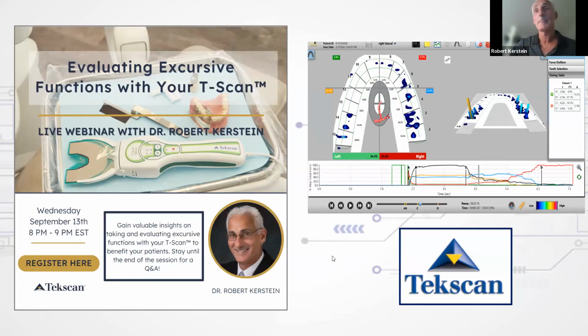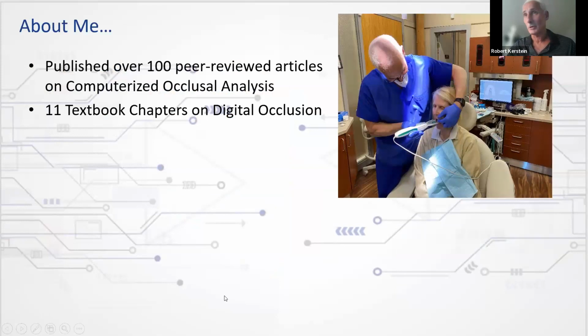So welcome, and thank you for the opportunity to teach you about the importance of excursions and how the T-scan technology can help you with your excursions. Okay, Shane gave me a small introduction. I'll just finalize it a little.